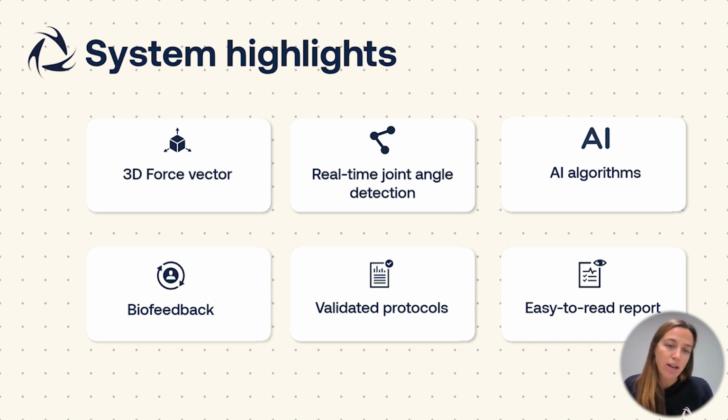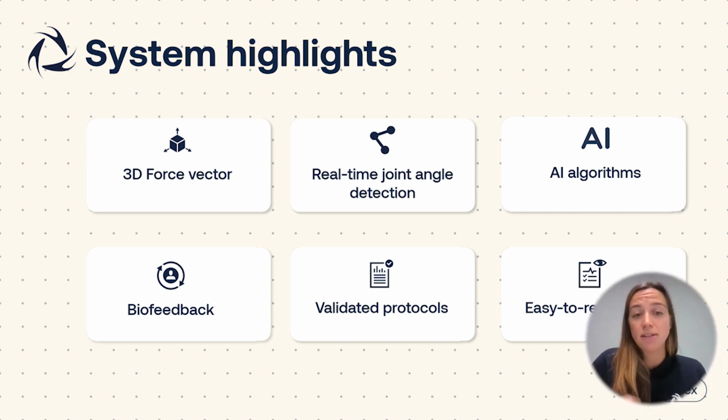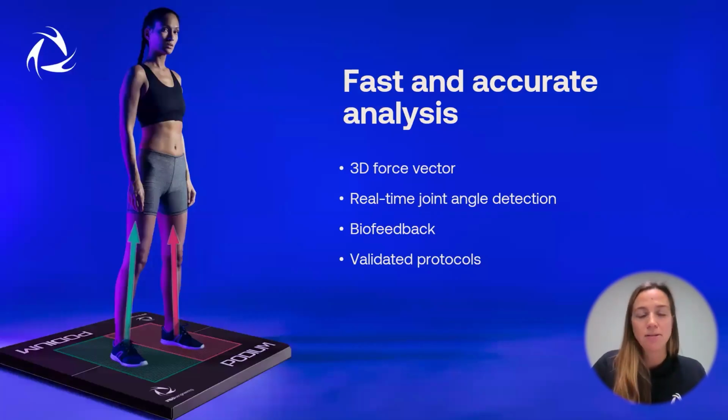So this very accurate system, of course, includes new algorithms, new and updated validated protocols, and also the possibility to have very easy to read reports that we will show you right away. It is a fast, accurate analysis. You ask your athlete, your patient, your subject to just stand on the force plates, and you will see in real time right away the 3D force vectors, the biofeedback.